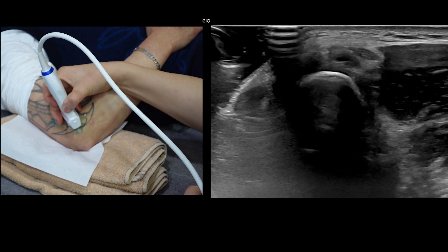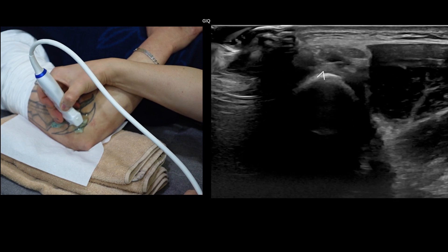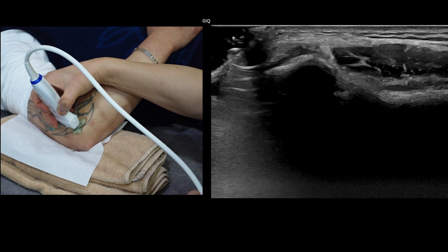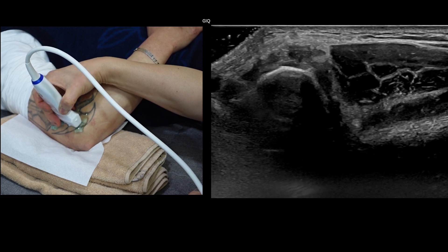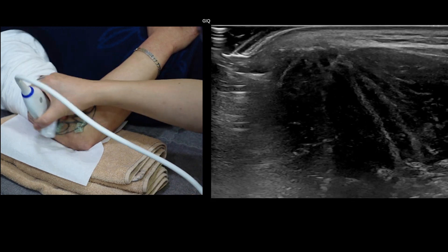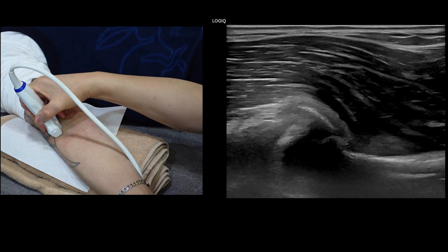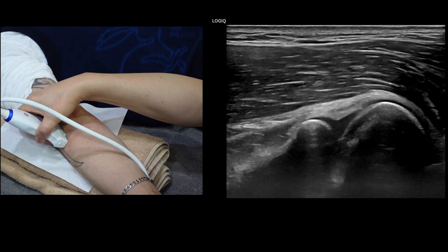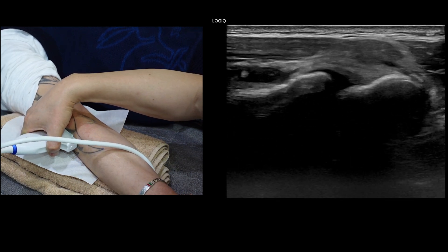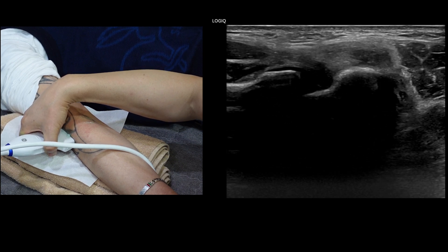This is a very important part of the transverse axis view of the extensor tendon. I will re-evaluate the tendon fibers with the elbow in full extension, examining the insertional tendon in longitudinal and transverse scan images.